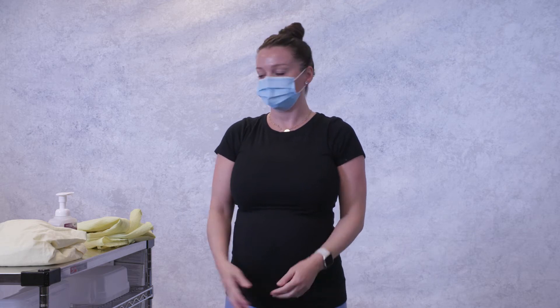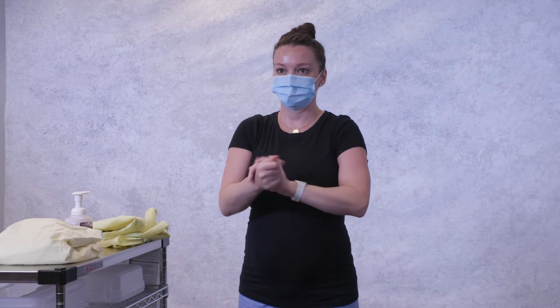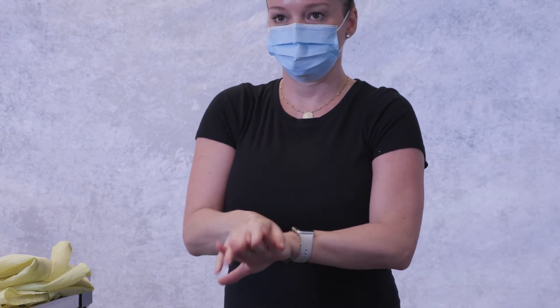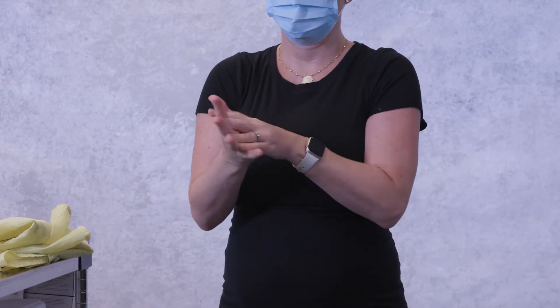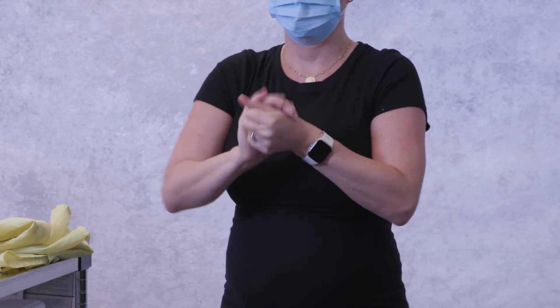The first step when donning an isolation gown is to perform hand hygiene with alcohol-based hand rub. Place one to two pumps of hand sanitizer into the palm of your hand. Make sure you rub the sanitizer on the back and front of your hands and between your fingers. Rub your hands together until the sanitizer has fully dried, about 20 seconds.